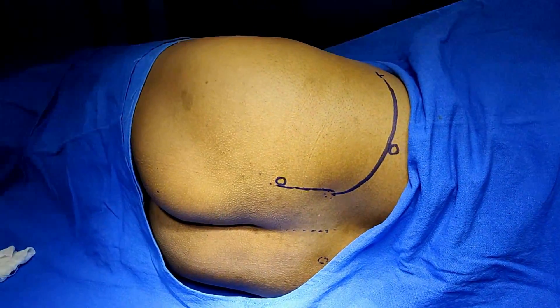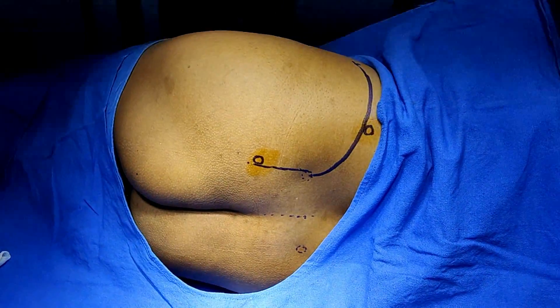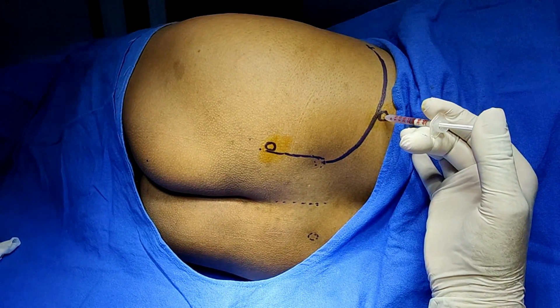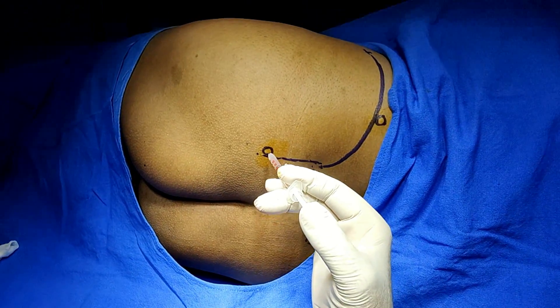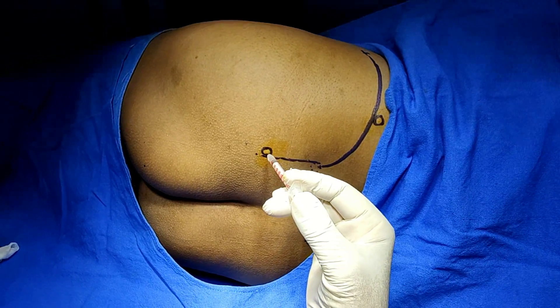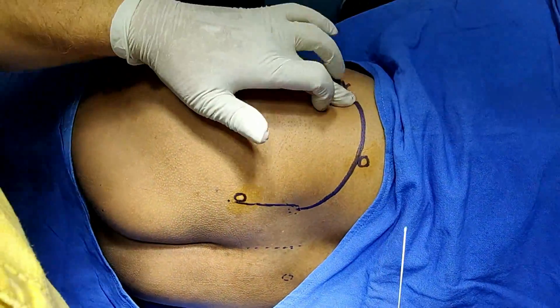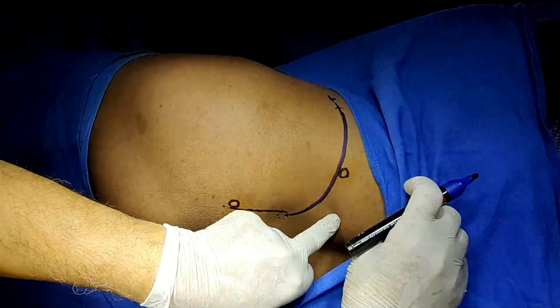I have already sterilized this area. Anesthetize these two points — inject subcutaneously in the center line, then come to the intradermal plane. At the second point, inject subcutaneously in the center line, then during withdrawal make it intradermal. This is painful, so I'm giving this block first.